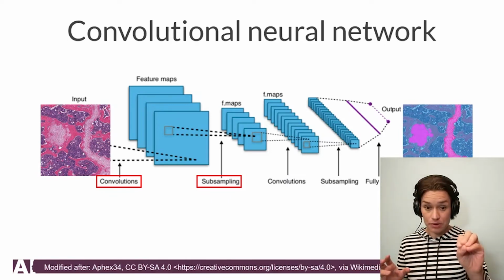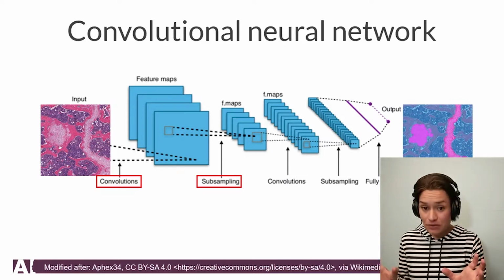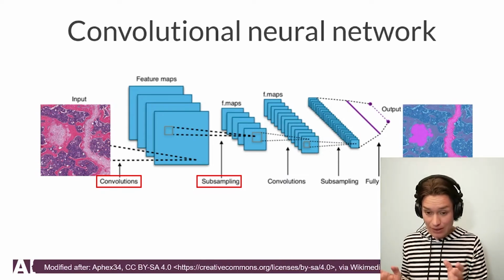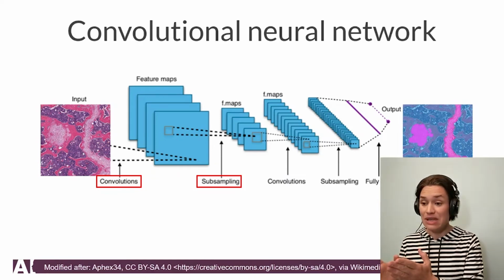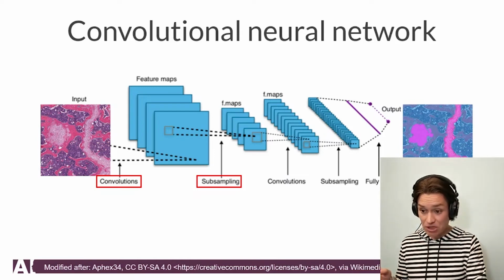And these images on the left and on the right correspond to each other, but the one on the left has a lot more information than the one on the right. The information on the right is binary, pink and blue, and corresponds to something meaningful in the left image. This reduction of information, this squeezing of information, is happening through convolutions and subsampling.